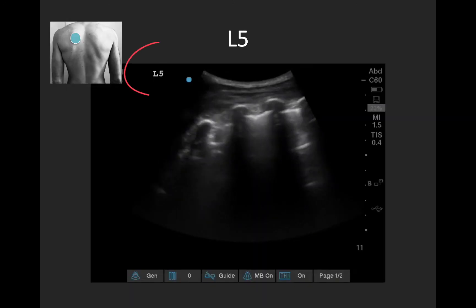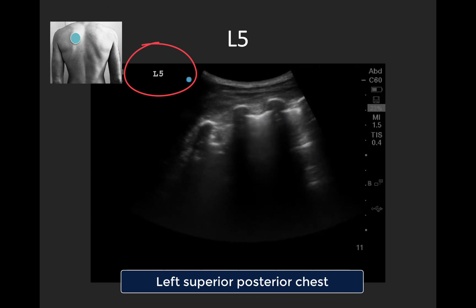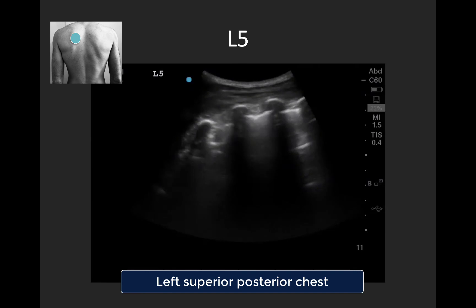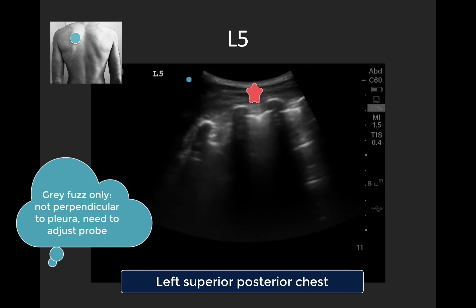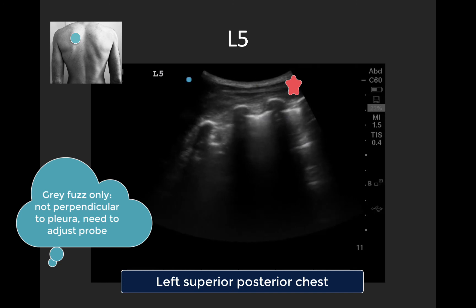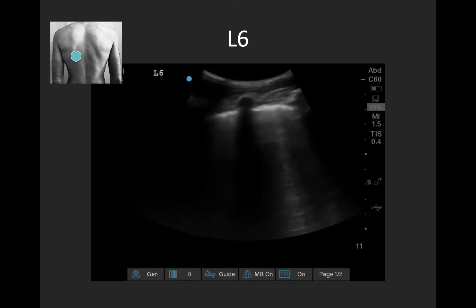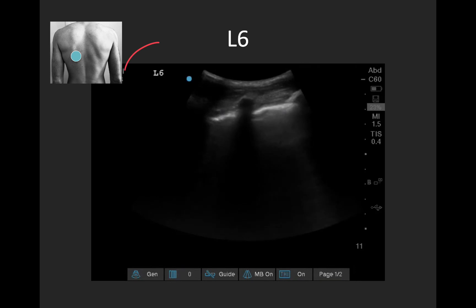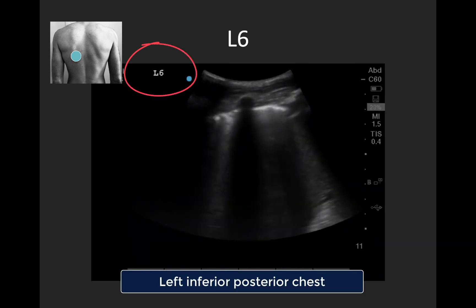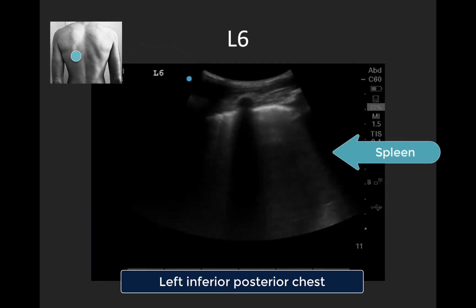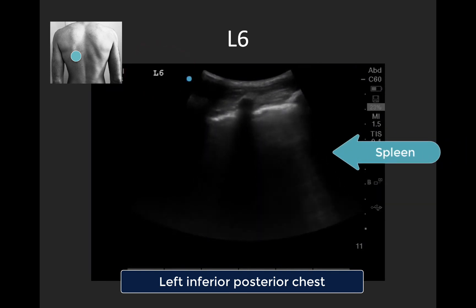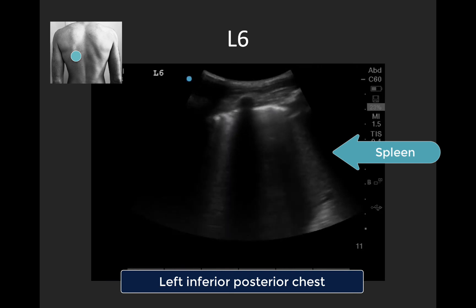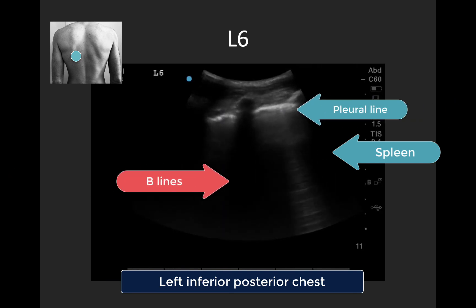Finally, two clips on the posterior chest. Here is the left superior posterior chest — L5 — often the trickiest spot as the ribs are quite close together. In the centered interspace we don't really see A or B lines, indicating we're probably not truly perpendicular to the pleura and would need to adjust with fanning. In the rib space to screen right, we see a couple of A-lines. And last, the left inferior posterior chest — L6 — a bit of a better image. We can see our intra-abdominal organ, the spleen, on screen right as a nice landmark, and a fairly bright, fairly horizontal pleural line with B-lines emanating down from it.